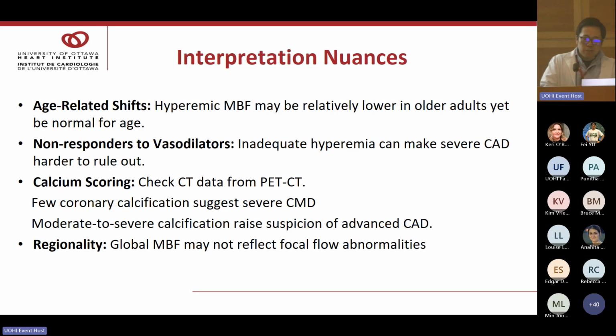A few words about interpretation nuances. It's essential to evaluate factors that may change or mask our interpretation. For instance, age-related changes can cause mild decreases in stress flow that might be normal for older people. And similarly, some patients can become non-responders to vasodilator stress if they consumed caffeine before the scan. So this makes it challenging to confidently rule out severe stenosis or diffuse CAD.